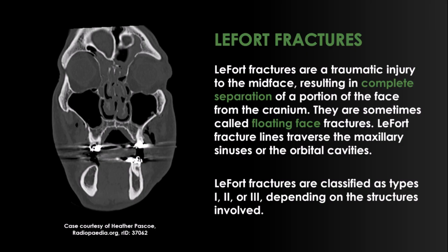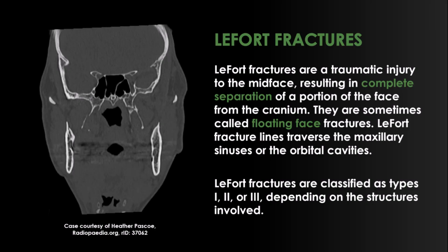This patient is an example. There are fracture lines on both lateral walls of the maxillary sinuses as well as both medial walls of the maxillary sinuses. If we move posteriorly, we can see this fracture line continues all the way through the midface.